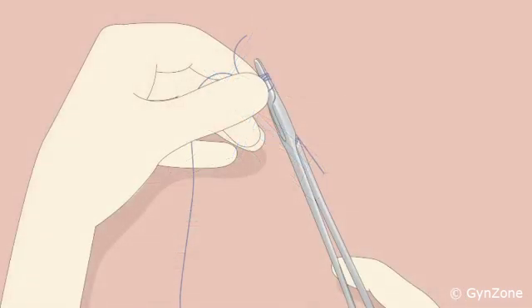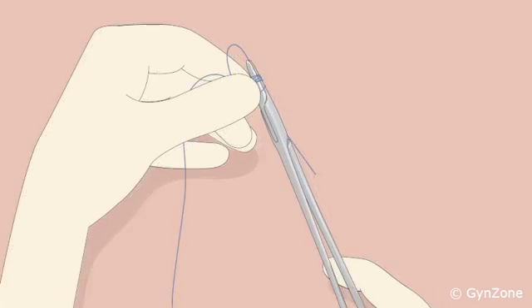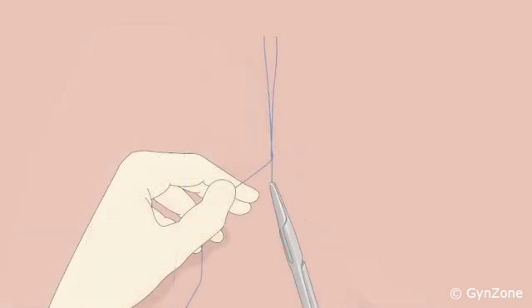When the needle holder has been wound around the threads 3 times, enough loops will have been made to create a stable knot. The short thread end is then gripped with the needle holder and pulled through the loops. To tighten the knot, both threads must be pulled in a parallel direction with equal force.